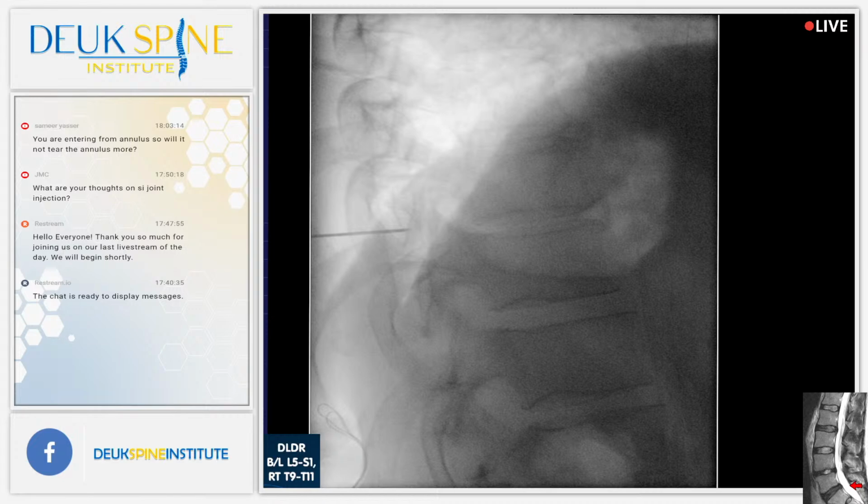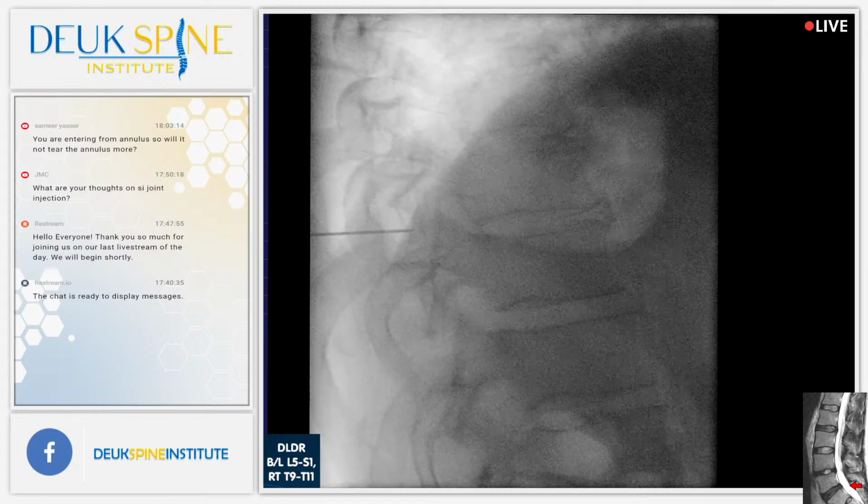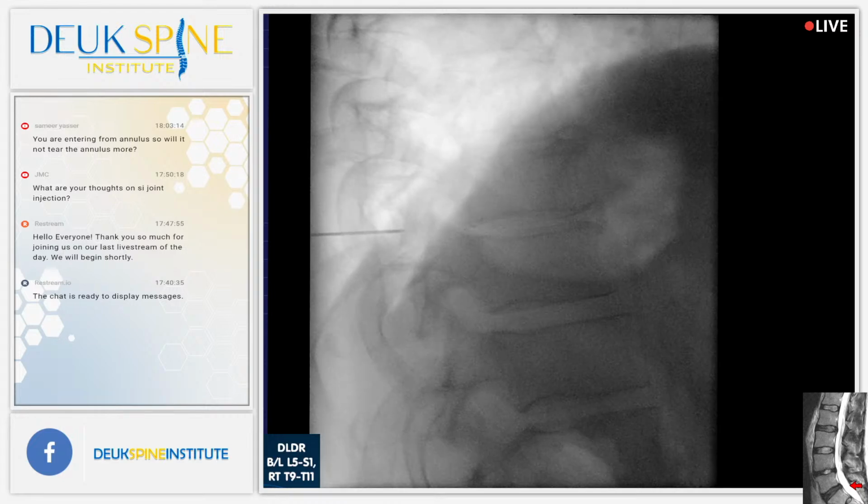I'm going to go a little bit more, see if that's... I don't know. Is that okay? It's a little too much. Go back a little bit. All right. We're definitely caught up on the facet. So I need to go. Just give me an AP and let's see what we're caught up on.